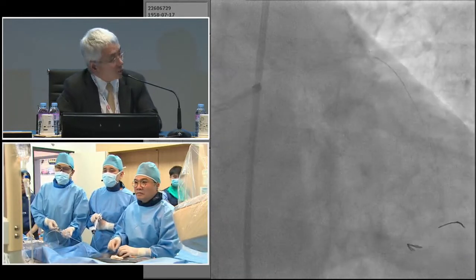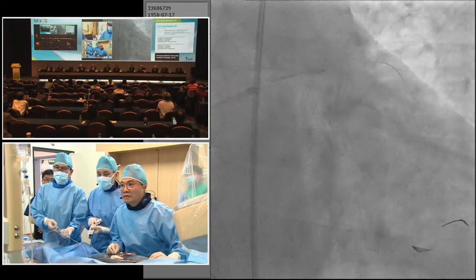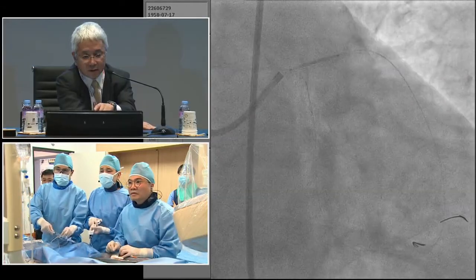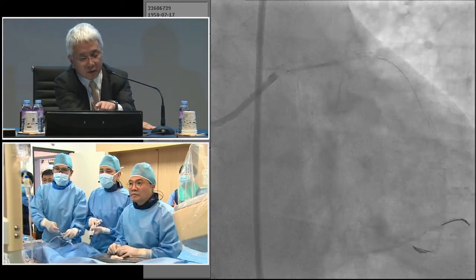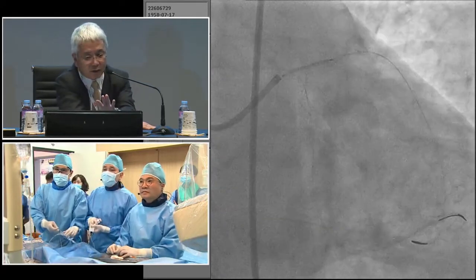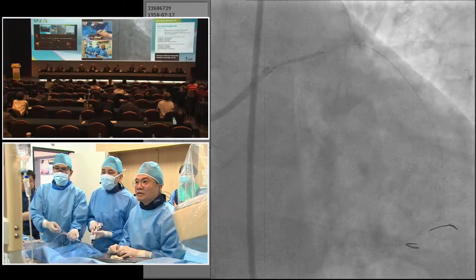And Dr. Hikichi, do you prefer synergy stent for left main complex PCI? Yes. How about Japan? Yes. Especially the synergy stent situation is very good. Not 3.0, 3.5 millimeter synergy stent expanded well, but 4.0 synergy stent expanded more than 5 millimeter.